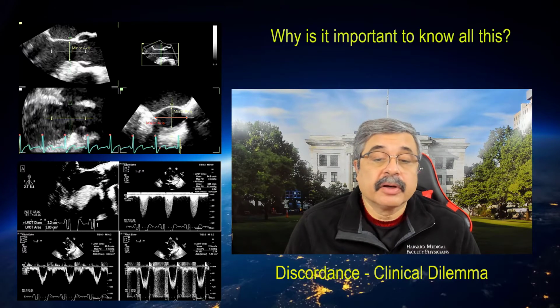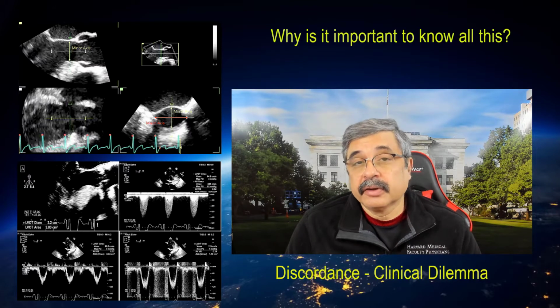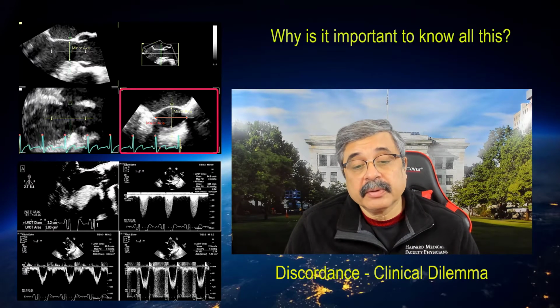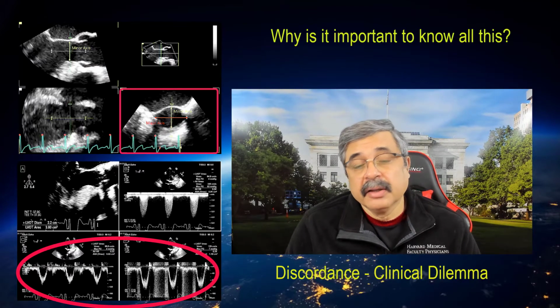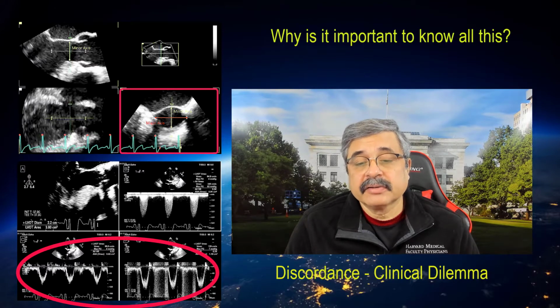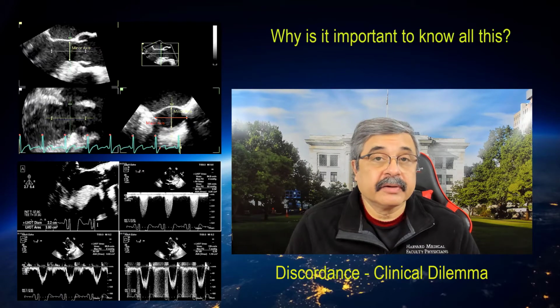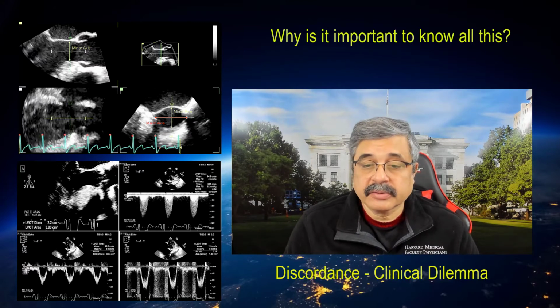Availability of three-dimensional echocardiography has demonstrated the variability in the structure of the LVOT and its impact on the calculation of the aortic valve area through the left ventricular outflow tract area calculation. Similarly, accuracy of the Doppler velocity profiles across the LVOT and aortic valve can also significantly impact the accuracy of the calculation of the aortic valve area. As we all know, the degree of systolic dysfunction can impact the opening of the aortic valve, and now we appreciate a condition such as low-flow, low-gradient aortic stenosis.